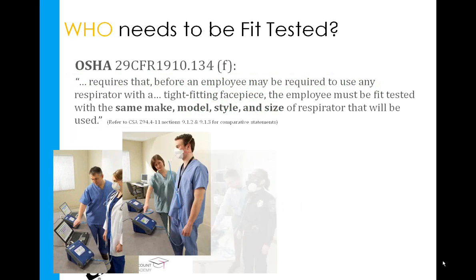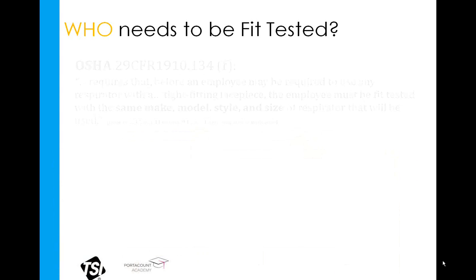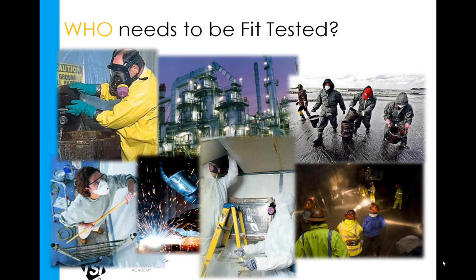So who or which occupations might dictate the need for fit testing? Anybody who is required in their occupation at any time to wear a tight-fitting respirator should be fit tested in that respirator. This would include many occupations in the health and public services fields: doctors, nurses, police, firemen, and of course, various divisions of the military. There are obviously many occupations in the private sector as well, which would require fit testing. People who work with food processing, refineries, mines, hazardous waste removal, welding, asbestos removal. And in the upper right, we actually see a picture from the Gulf Coast where the oil cleanup took place. These cleanup workers would also have been fit tested before entering the contaminated work area.